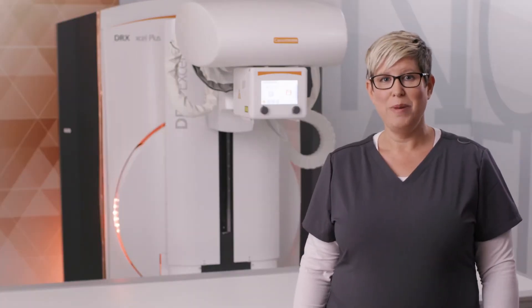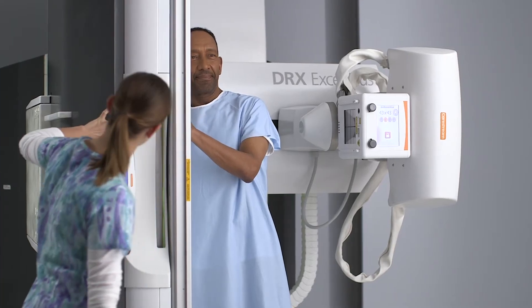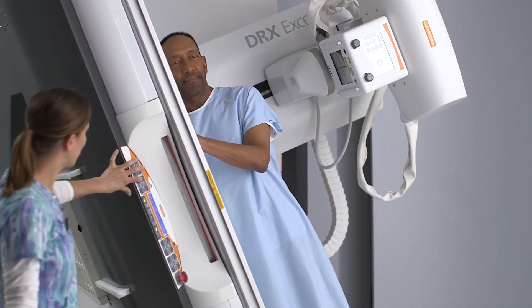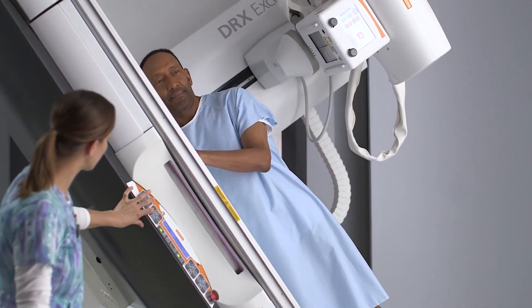The table side control pad allows the user to control all table movements, including height, tilt, panning, and tube movements. It can also control the motorized compression cone, the grid, and the collimator light. From the table, there is a button that will allow you to switch from tracking mode to direct mode, giving you the ability to switch to a CR cassette or a wireless detector.